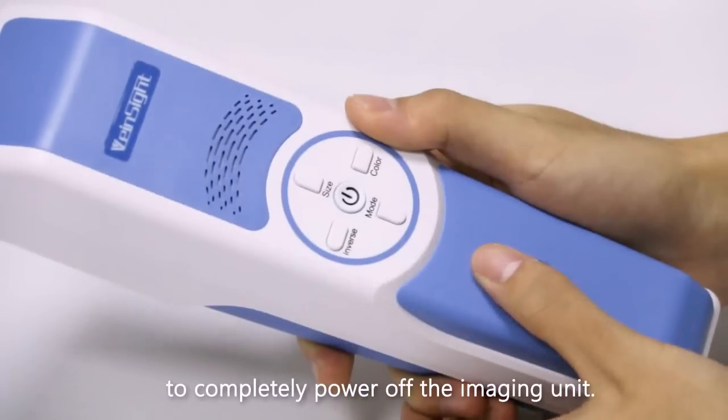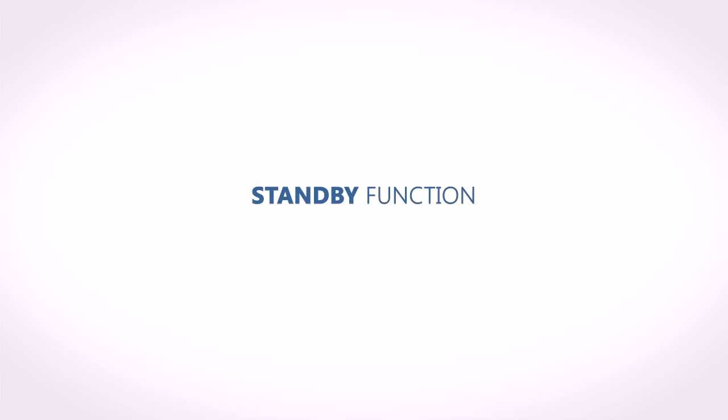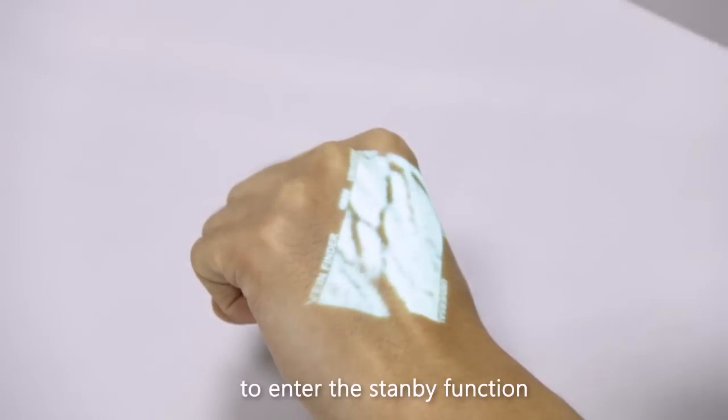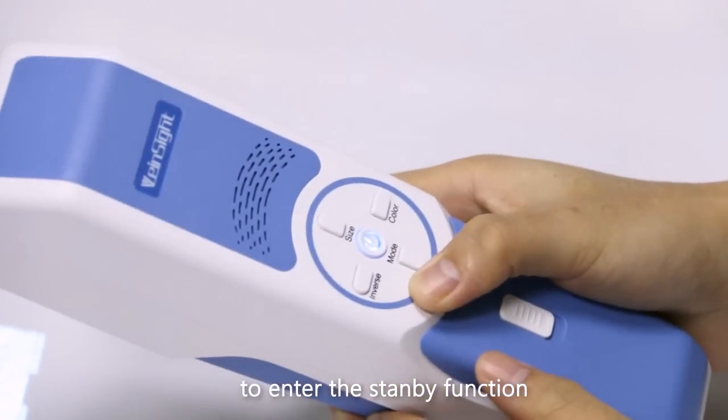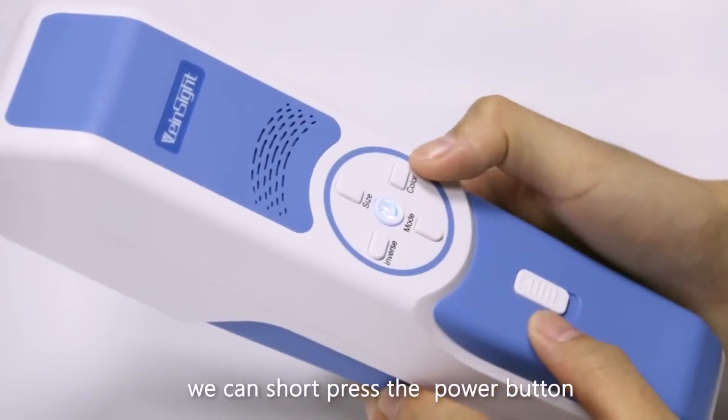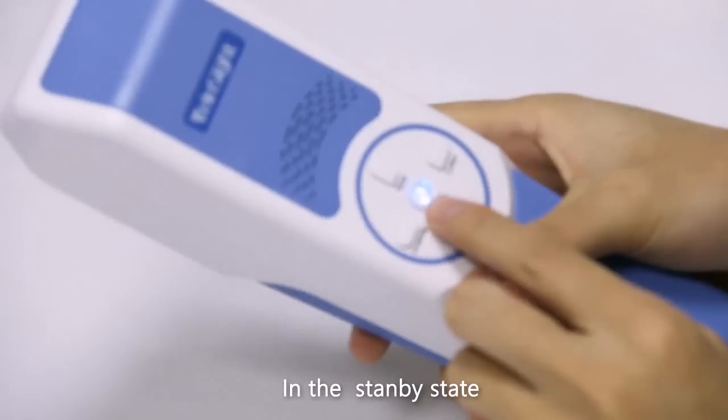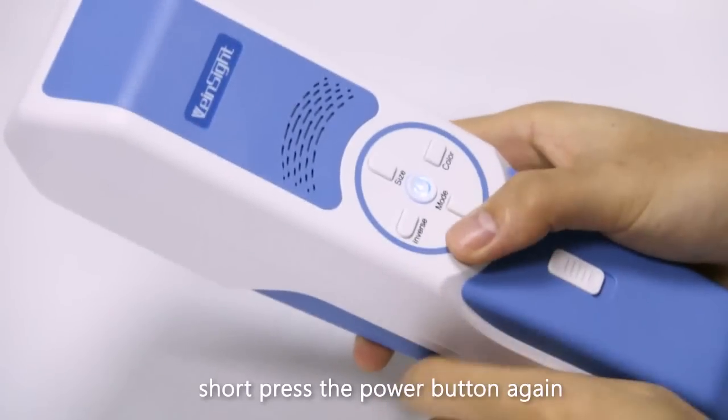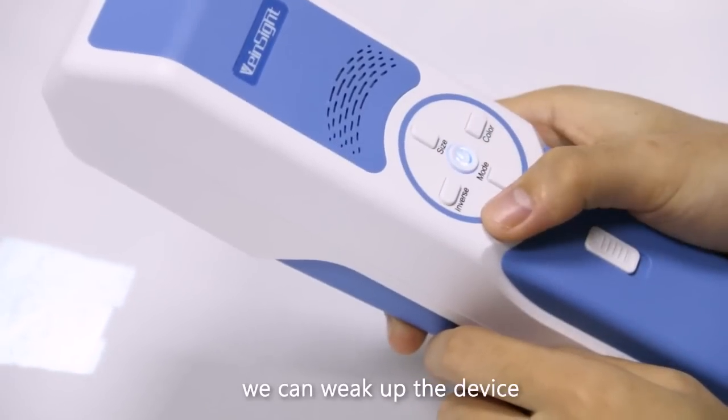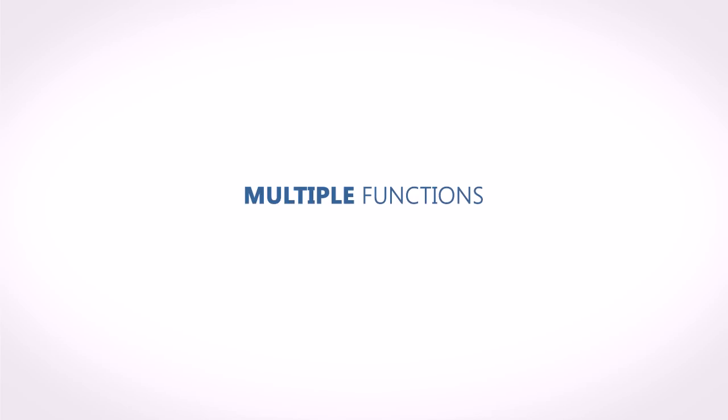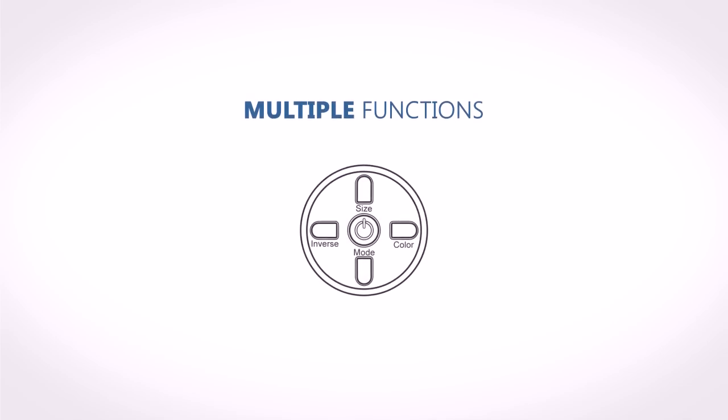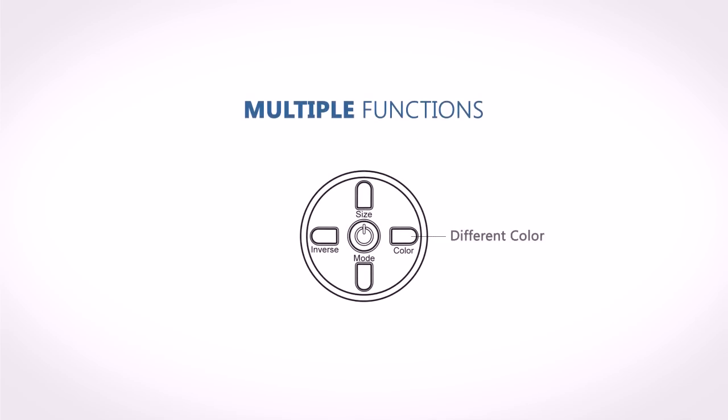VS 400 has a standby function. To enter standby, short press the power button when the machine is powered on. In the standby state, short press the power button again to wake up the device.